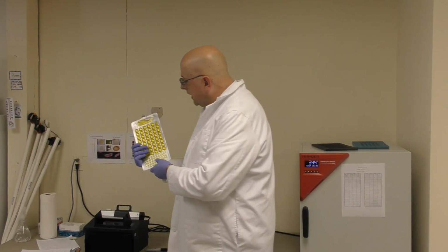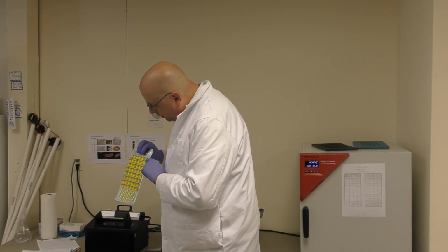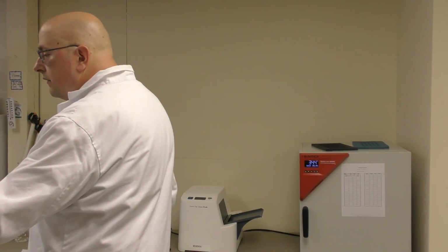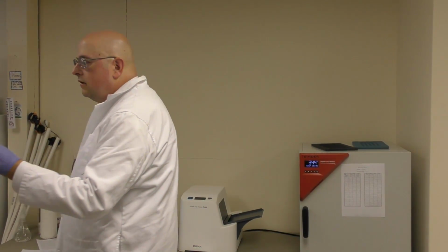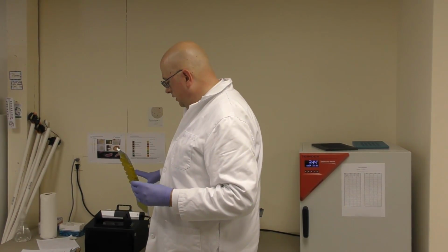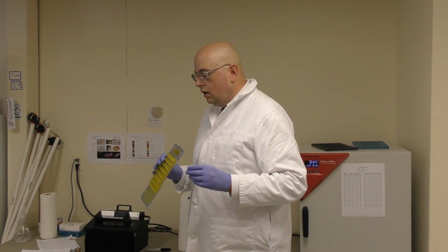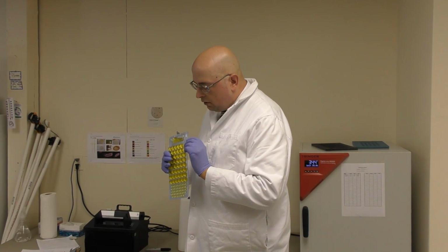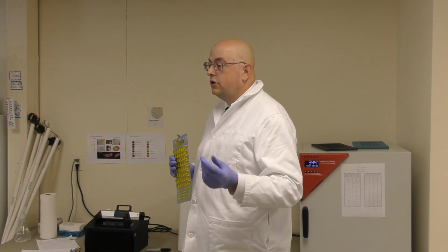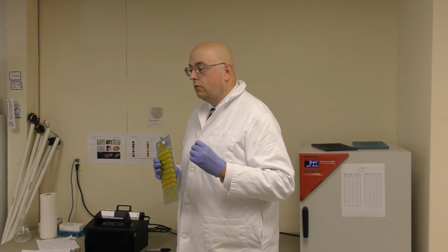You'll notice here on this particular tray, this cell right here is about halfway full. So it's got a bit of a larger, more notable size bubble. If you're any less than that, then you may want to not count that well. So again, if you shake your Quantitray before you run it through the sealer, it should eliminate those bubble issues. But if you have one that's half full or less, it's very difficult to determine if that color you're seeing is due to the bacteria being present or just because you have such a smaller volume that you're dealing with.